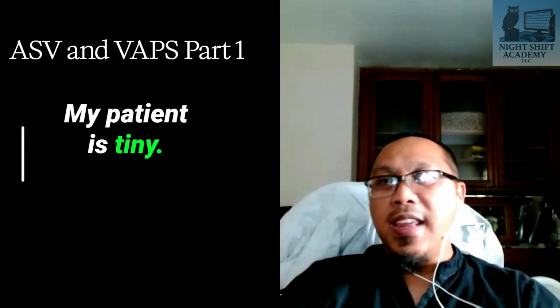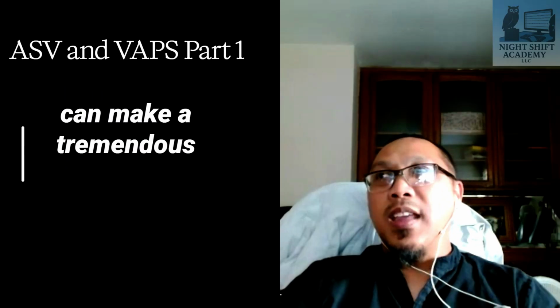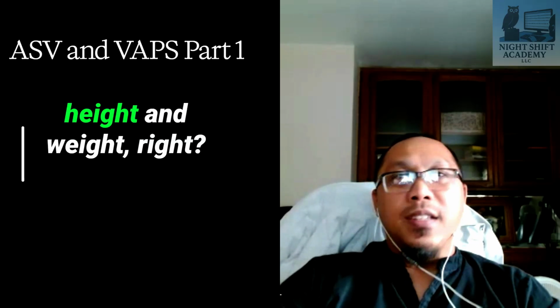My patient is tiny. Maybe this patient can immediately react to an IPAP of 8. Maybe that one pressure difference can make a tremendous effect on your titration. So always look at the patient's height and weight.